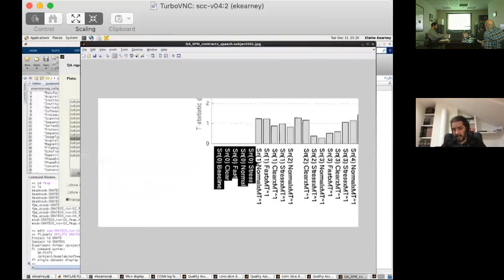So in this case, if for session 2, I don't see. Yeah, it's probably the latter, because it's happening a lot for the stress times motion, right? But it's not happening in the clear or in the normal conditions. So it's perhaps the latter. Perhaps just that the duration within the stress condition for that particular session happens to be correlated with something else, which likely is going to be motion or some of the other things that we are testing, because everything else is going to be orthogonal.